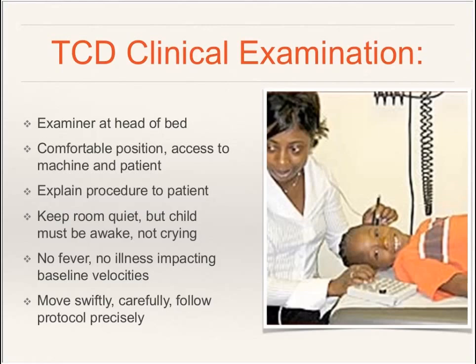If the child comes for a sick child visit and they ask you to do a TCD on them because they're already there, you need to instruct the physician that that's not a good idea, because their physiology is out of whack with fever, and this could actually impact the results of their TCD study, and you could actually overcall a child as being abnormal when they are actually normal.